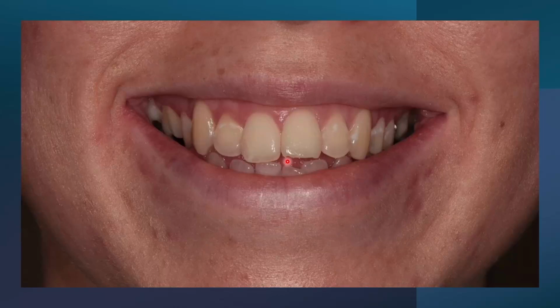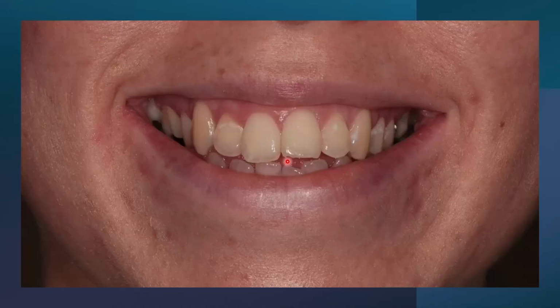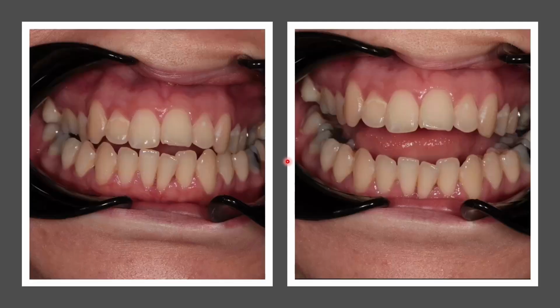I can understand why somebody would want this fixing, but we have a lot of occlusal issues at the back, and in aligner work we would sort of call that a cuspy occlusion. It doesn't look particularly stable, and so it's important in a case like this, when you see the complexity at the back, we're asking ourselves, do we want to fix it or not?